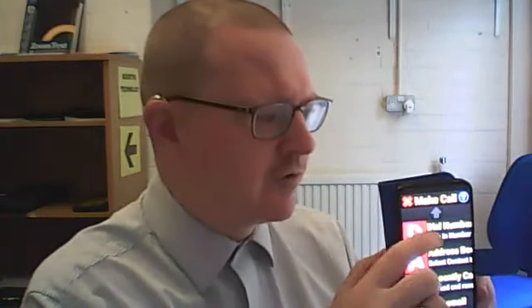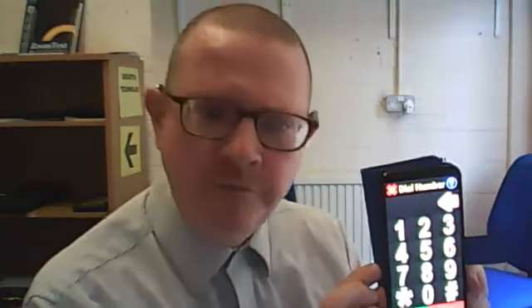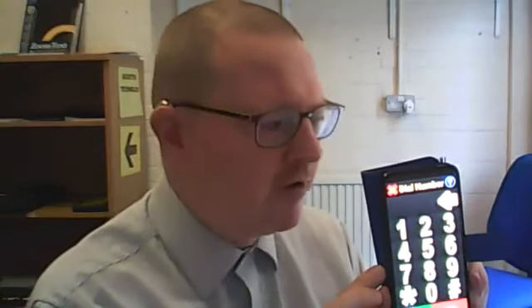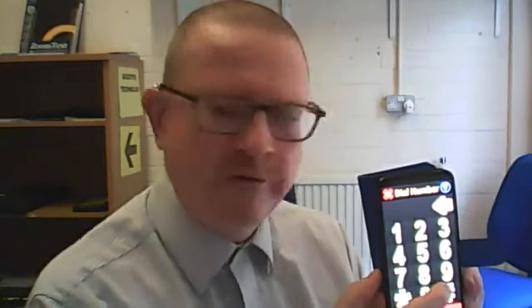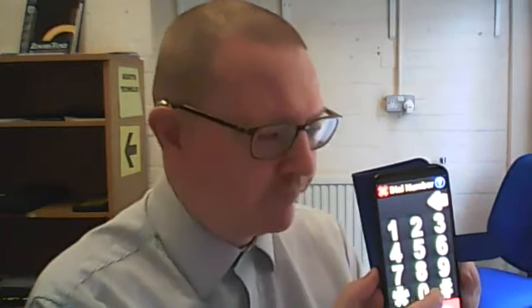So I'm going to go to make a call, use the dial a number. Dial number. Type in number. Number pad. Dial number. And that's a beautiful keypad there for someone that's got low vision. Very bright, very big, easy to see. And I could dial a number just by moving my finger around the screen and letting go when I find the number I want. I'm going to dial the number for Sight for Surrey, hopefully.